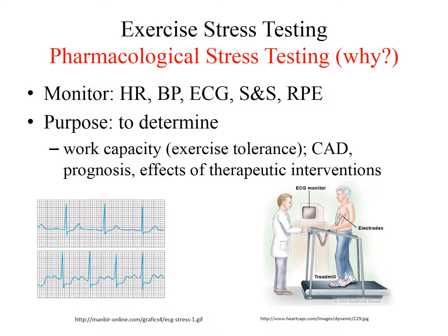A popular testing protocol is the Bruce protocol, for which the patient walks on a treadmill while the speed of walking and steepness or grade is increased in incremental stages. The test continues until the patient requests to stop or until abnormalities are identified.